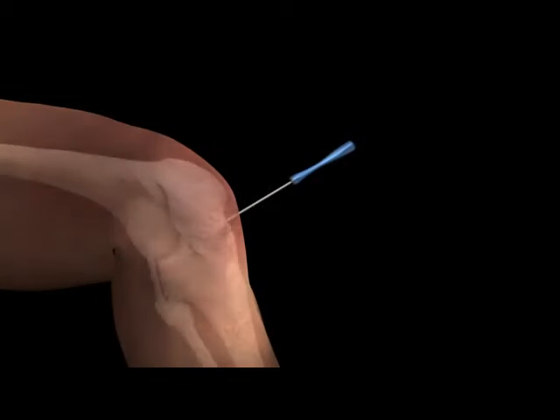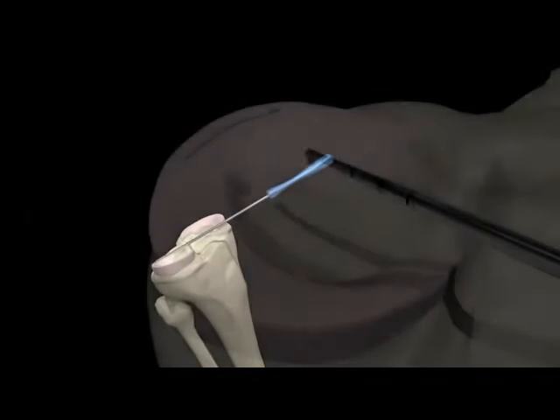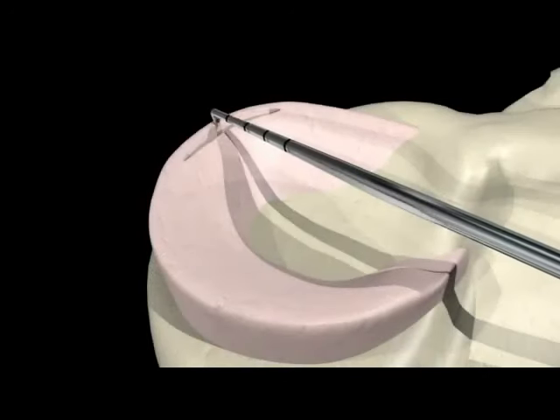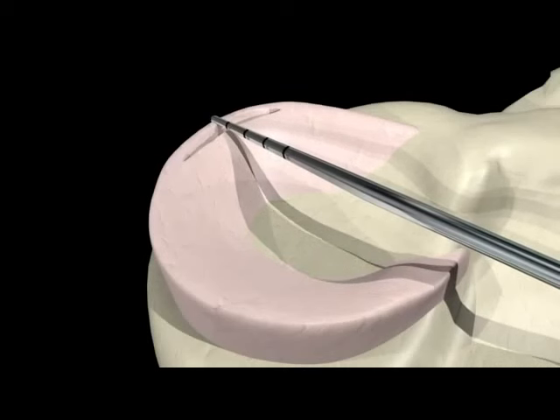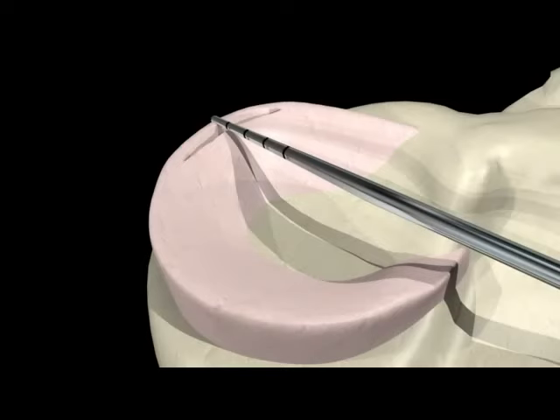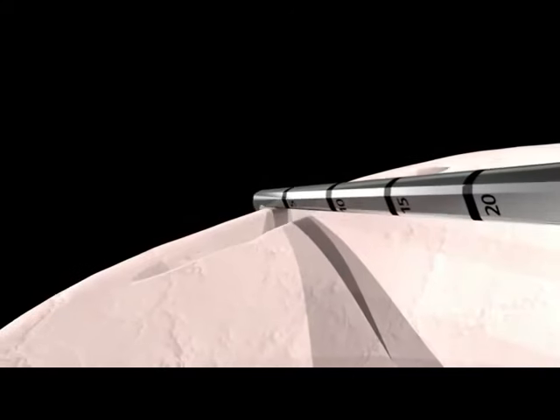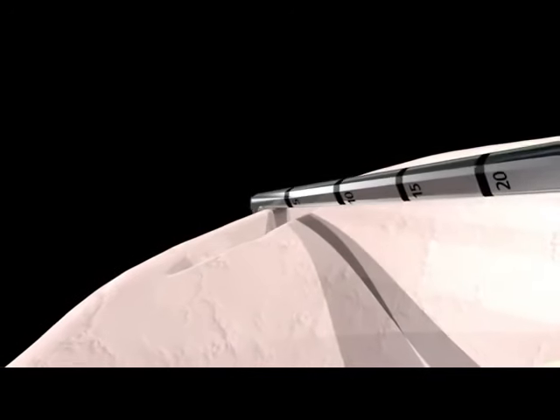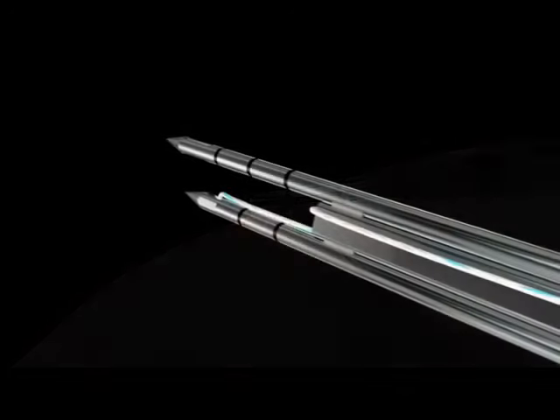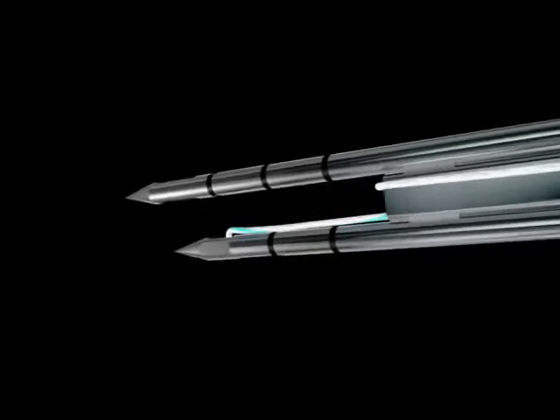Using the Covidian meniscal probe, approximate the distance from the capsular side of the meniscus to the desired needle penetration point at the repair site. The probe is advanced to the back of the meniscus and visually assessed. Depth laser markings on the probe are indicated at 5 mm increments, as are the depth markings found on the needles of the AS meniscal repair device.